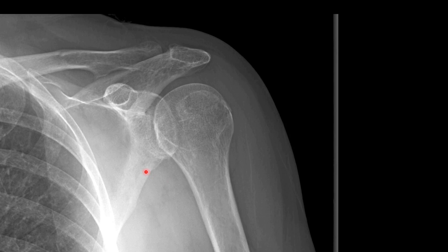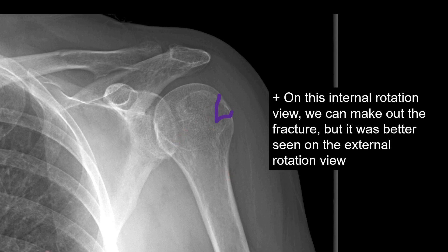Here's that same patient, this time in internal rotation. If you follow the contours of the humeral head, you can still make out some of these fracture lines, but it's not as easy to see as on the external rotation view. I've gone ahead and highlighted those fracture lines for you to show that it's more difficult to make out.